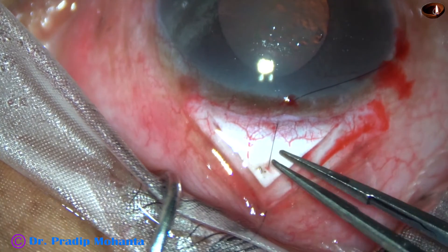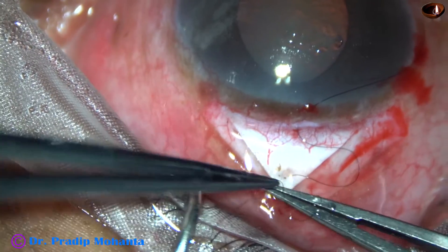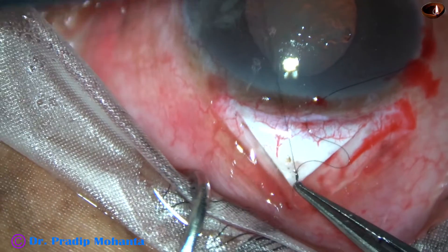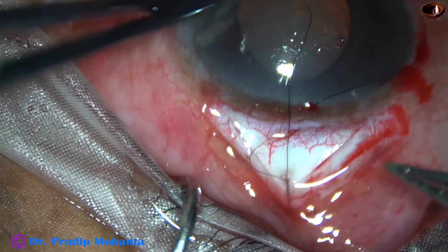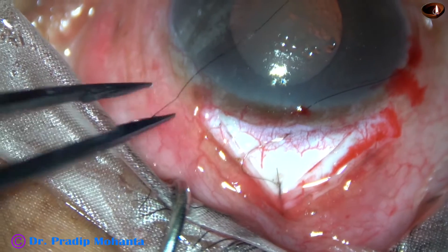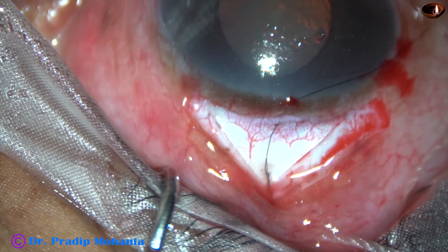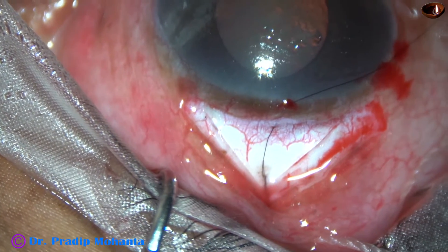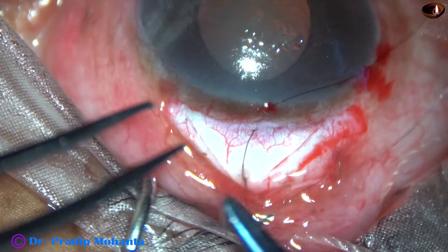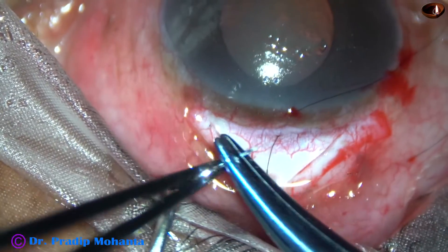Now I tie the pre-placed releasable suture at the apex. This is a releasable suture — three throws: one, two, three. Hold the suture and pull. Now cut the longer thread with the needle, and the other thread is outside. As we pull this thread, the apex will open and aqueous will go posteriorly.